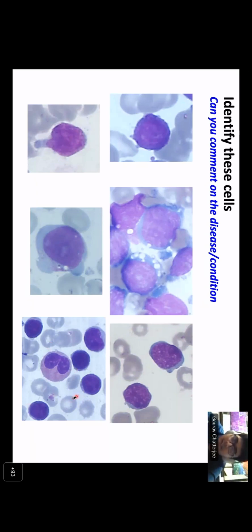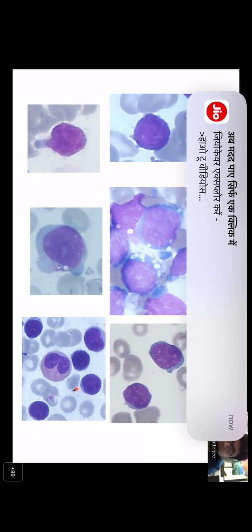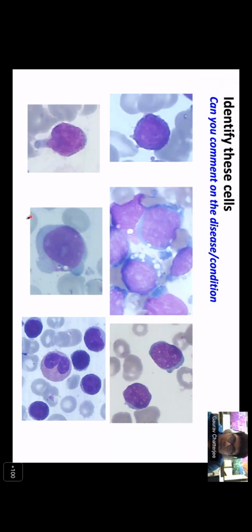Now that we have discussed all the 6 images, which of them do you think are lymphoblasts? Which of them do you think are normal? Which of them could be myeloblasts? Shivangi, and which could be a mature lymphocyte? All of them look like blasts to you, Shivangi? All the 6 pictures? No, sir. The last picture shows normal lymphocytes. Right. So let's not make a normal versus abnormal distinction yet. So this looks like a mature lymphocyte. That's what you mean to say, right? Yeah, and the rest all 5 look like blasts to you.